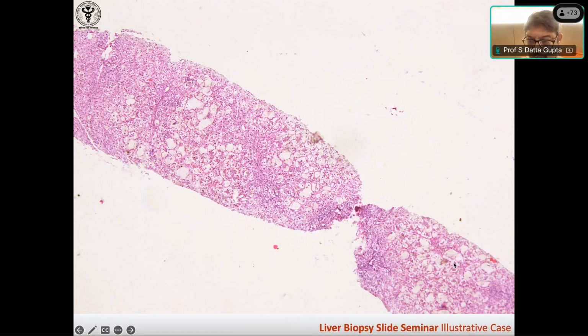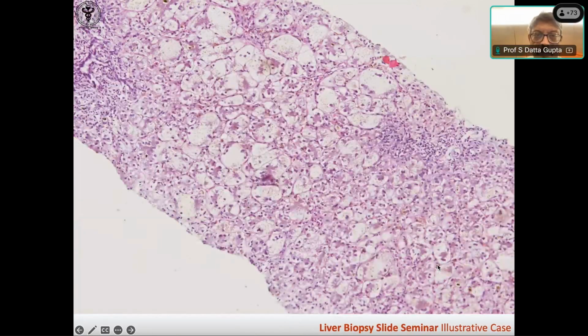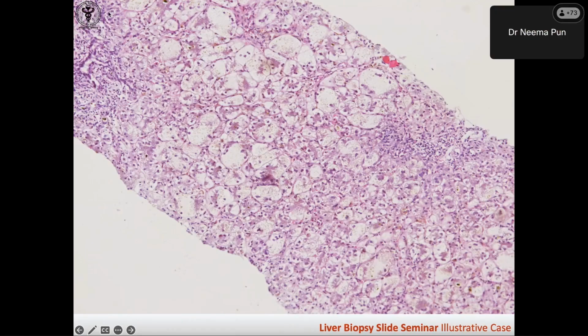And you're finding these large spaces. Let's go. Oh, they're all balloon cells. See? They're all nuclei. And you're seeing this, there's some brownish yellow, it looks like. There must be some cholestasis. Portal tract. Yeah, portal tract here. Inflammatory cells. Little bit of piecemeal necrosis, that's fine. But what you're finding is diffuse ballooning, right? Okay, good.